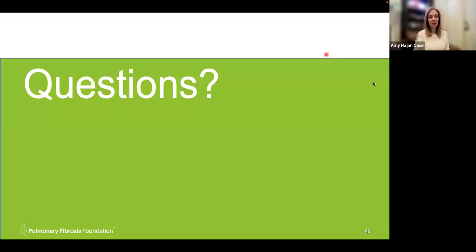And then you showed the trending, which I thought was so helpful. That's what I do in clinic, create a chart like that for myself to look at. I'm not necessarily thinking about everybody's percentage that day. They make an A, B, C on the test, but what do they look like in context of their own historical and baseline values? And then you have to take that in the context of the whole clinical picture. How are people feeling, functioning at home? Has their oxygen requirement changed? Do they have new imaging that shows something different? So it is sort of a piece of that whole puzzle.